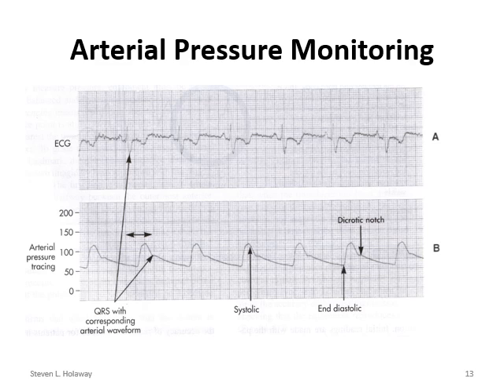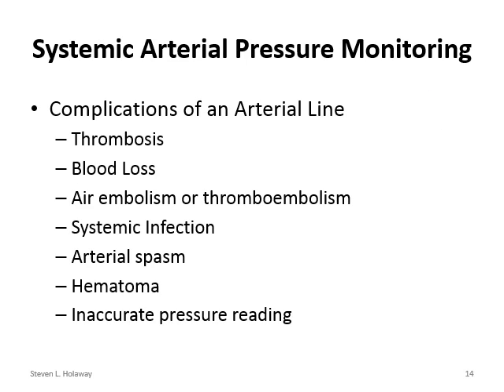If you didn't have a readout, you could come here and go across and see what the pressure was. The systolic pressure on this patient is about 110 or so. So that's another way to look at the blood pressure. Fortunately, you don't have to do that. It's all on the monitoring system now.